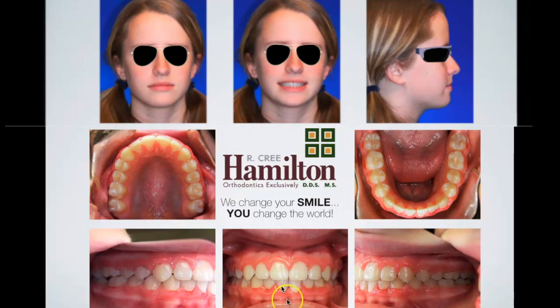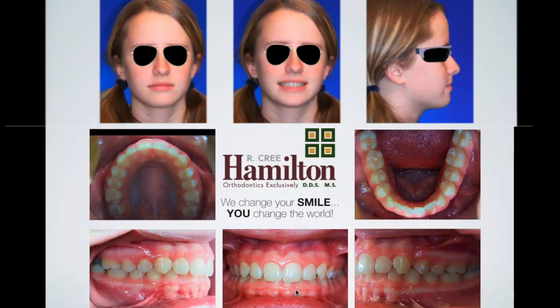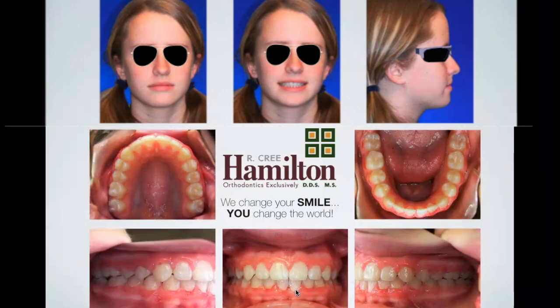Long-term. Yeah. So you look down here, you can see, again, this was the area that was crowded. So we back up here, right? You can see that these teeth were crowded. And that's one of the things that we have to be careful about whenever we treat an orthodontic case, right? That you avoid moving those roots facially.